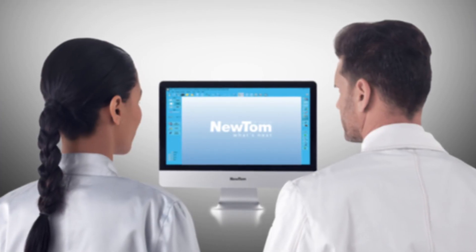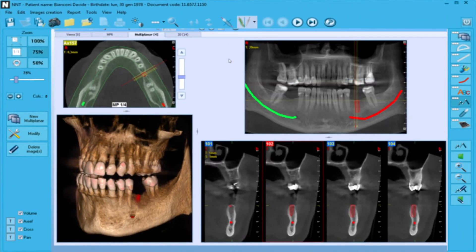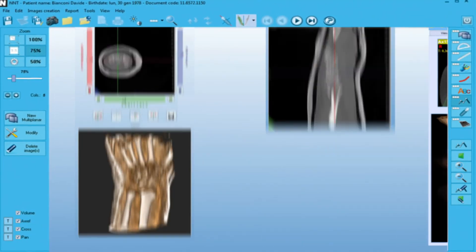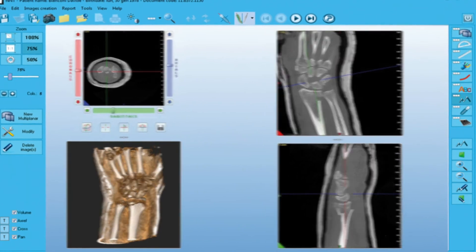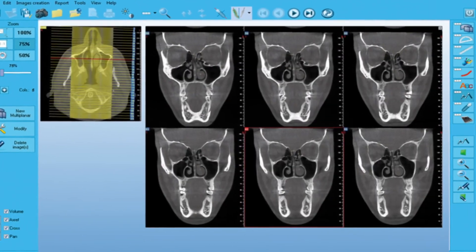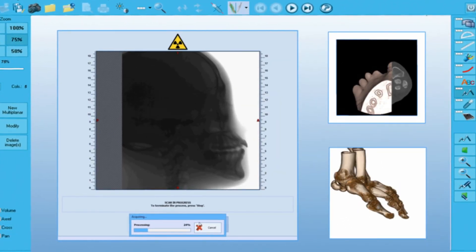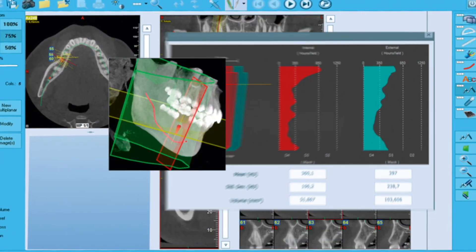The 5G XL extends CBCT technology into multiple fields of application, offering all-round diagnostic capacity.